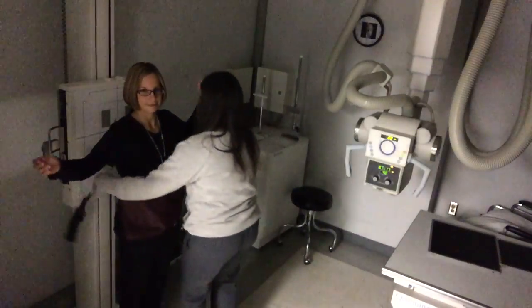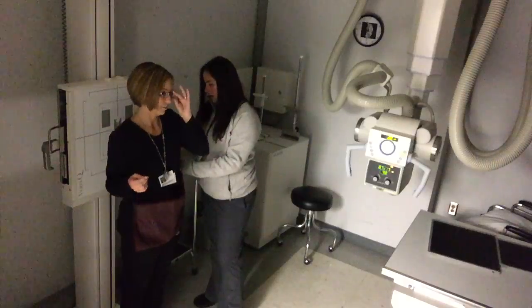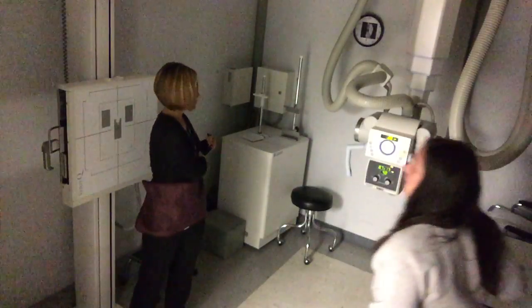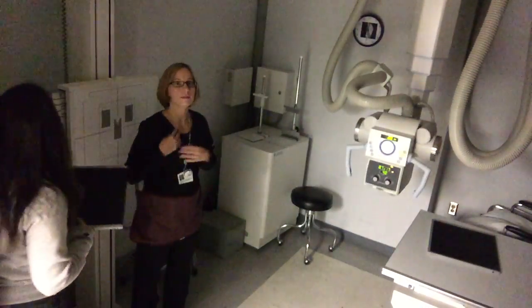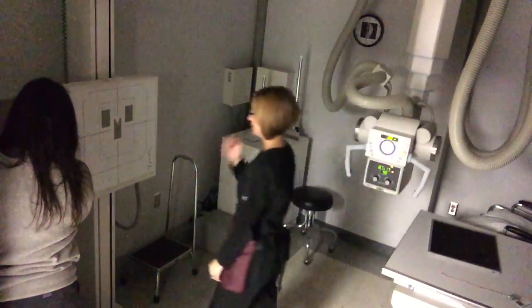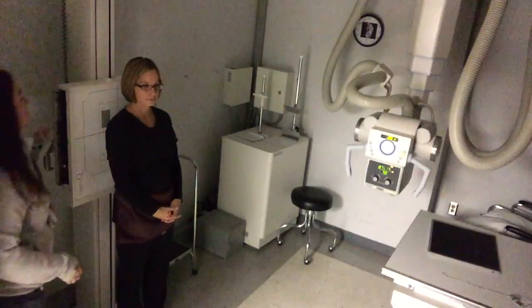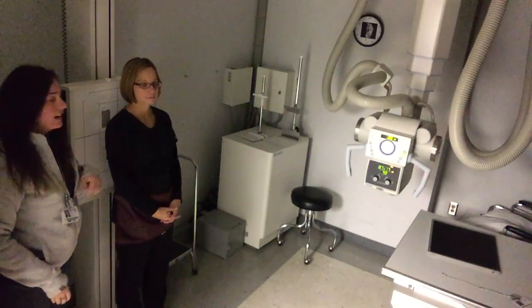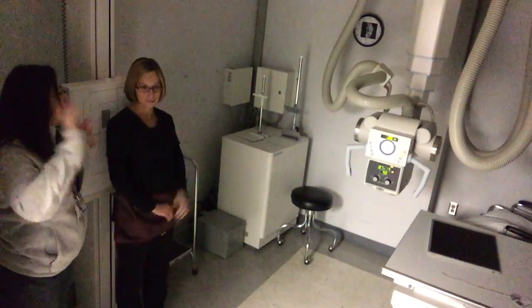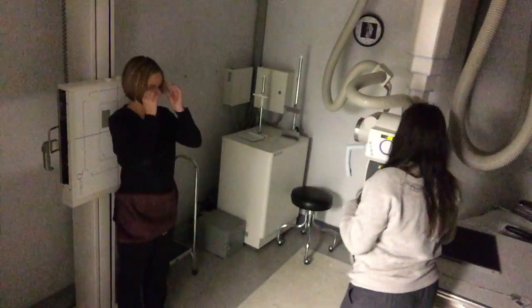First we're going to put a shield on her. We'll be using a 10 by 12 IR for all three of these. Grab that and stick it in the Bucky with the orange sticker facing down. You'll have to use your little lever here and put that in at the 12. When prepping your patient for this exam, you'll want them to take off any earrings, eyeglasses, necklaces, hair ties, hair pins, and anything that might show up right behind their C1 on the open mouth.